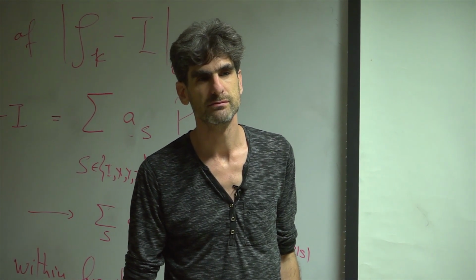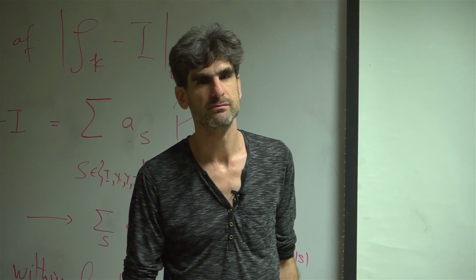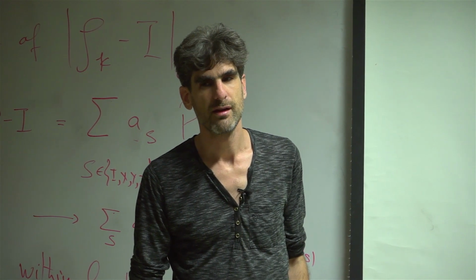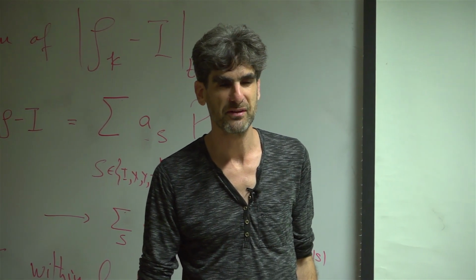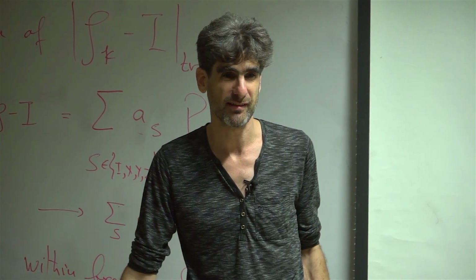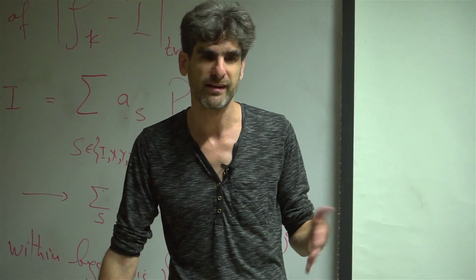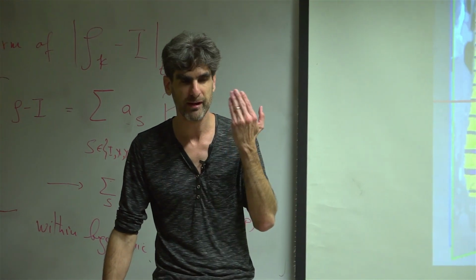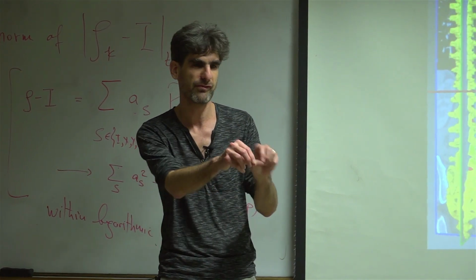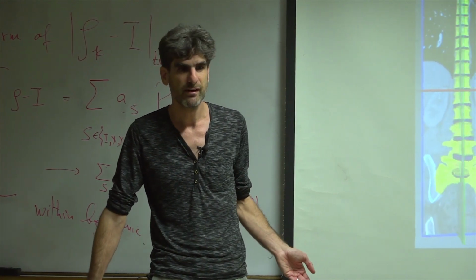So continuing a previous question, how hard is it to transfer learning from regular networks to things that have to do with medical applications? Is it completely worthless, or is it sometimes worth starting from regular networks? In some cases we have found it's useful, more for things that look like natural images and less like a CT scan, which maybe you and I intuitively can understand because we have a basic notion in our visual system of edges and blobs and areas, and maybe we've seen a model of a bone, but it still doesn't look anything like the images from ImageNet.